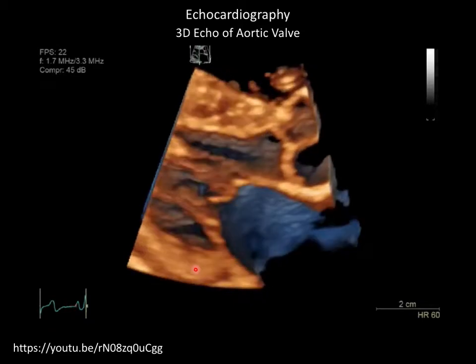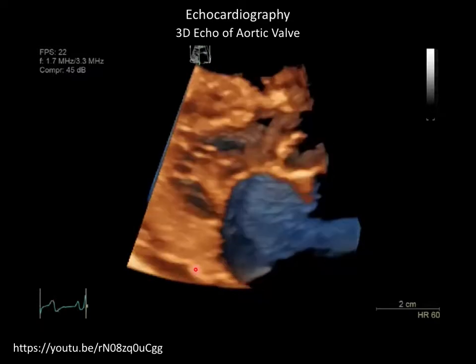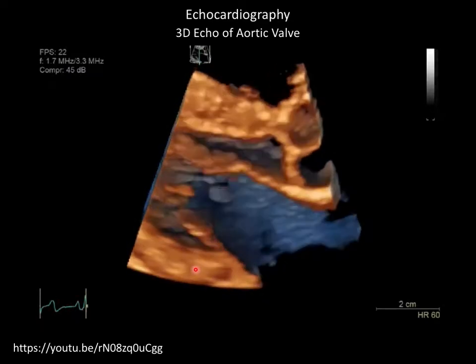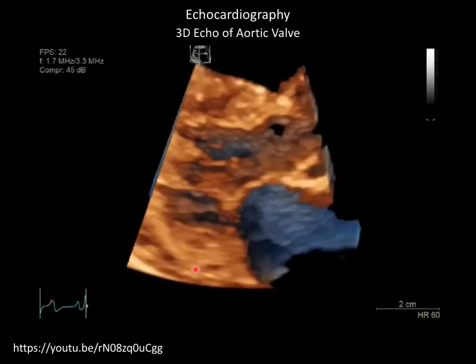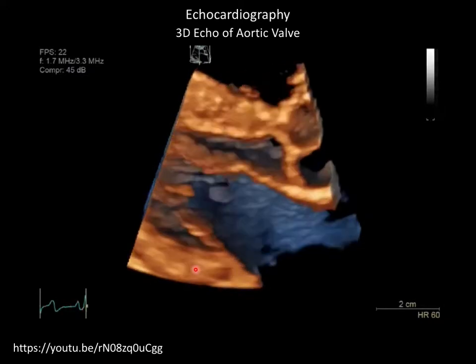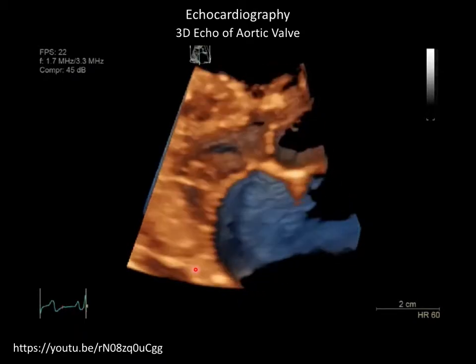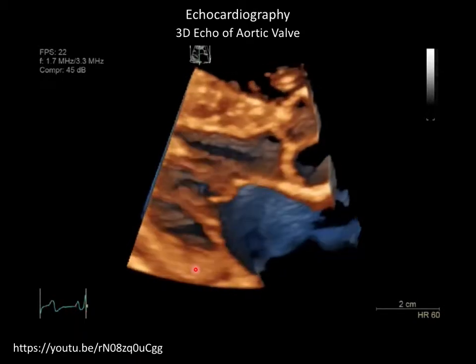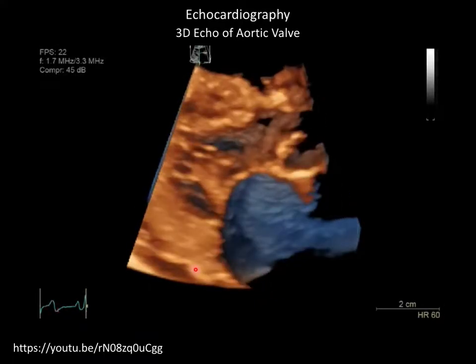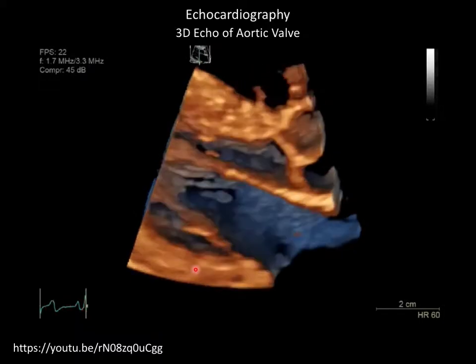Now that's CT. There is no radiation with ultrasound. There's just heating, but I don't think anybody has measured any deleterious effects of ultrasound heating for echocardiography. You can actually use, as I said, ultrasound heating for therapeutic tissue ablation for tumors, for example. You ablate the tumor. And ultrasound is used in physiotherapy to heat up muscles. So they'll put an ultrasound transducer. Say you've got shoulderitis. They just put the ultrasound transducer on your shoulder and heat it up with the ultrasound.